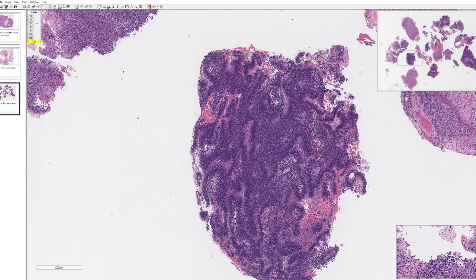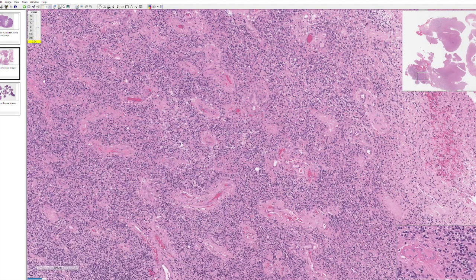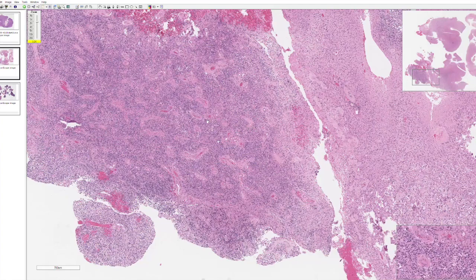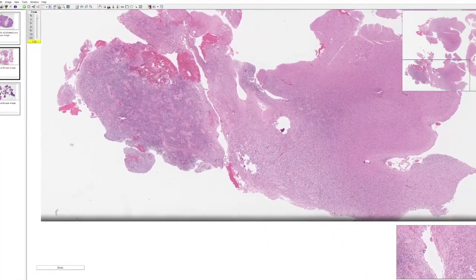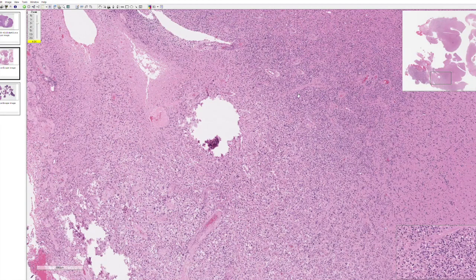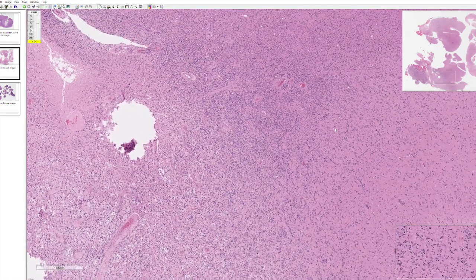So if these features, proliferation, microvascular proliferation, are not working, what other features of the tumor biology can we see that would be of relevance to developing new therapies? Now, one thing you can see here is that this tumor is very, very infiltrative, and one of the other forms of therapy, which is surgical resection, its goal is to cut out as much of the cancer from the brain as possible. But this infiltrative biology of the tumor makes it very, very difficult for a surgeon to completely remove all the cancer cells.